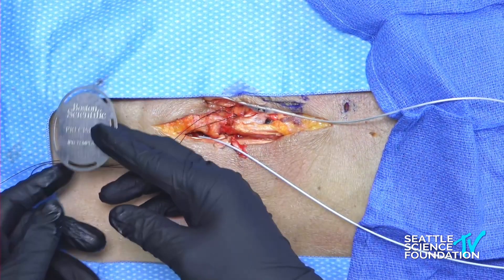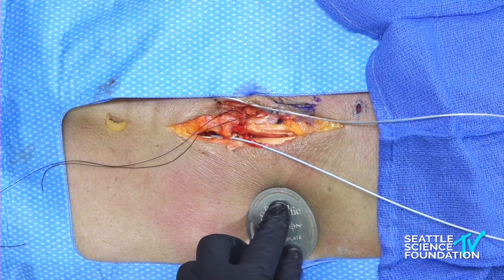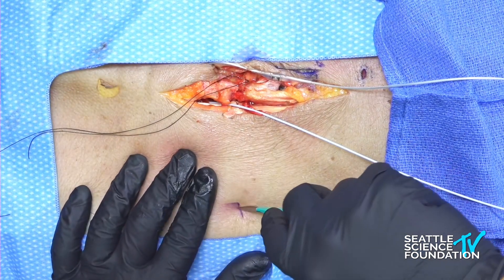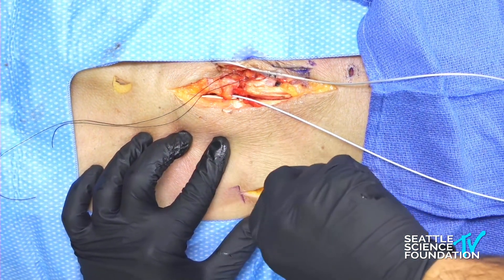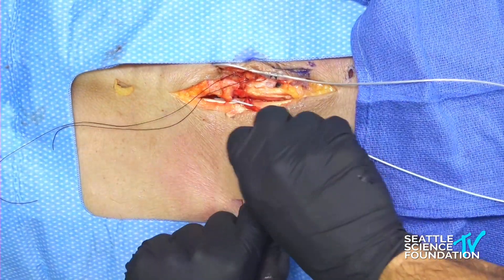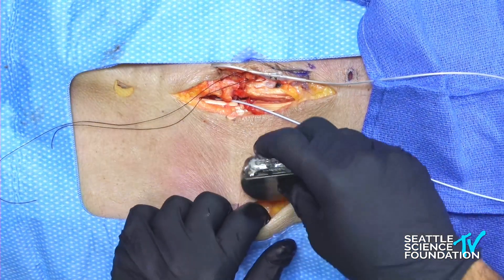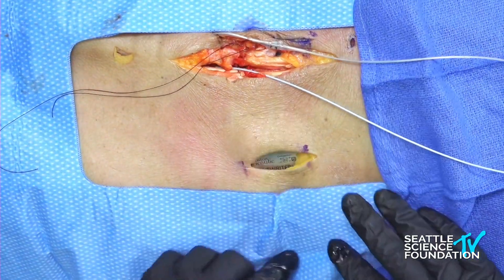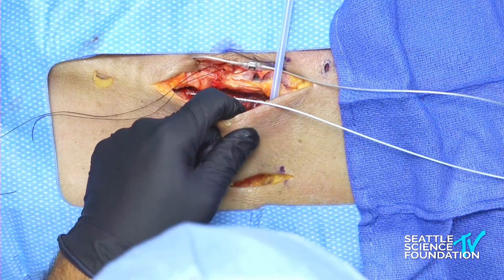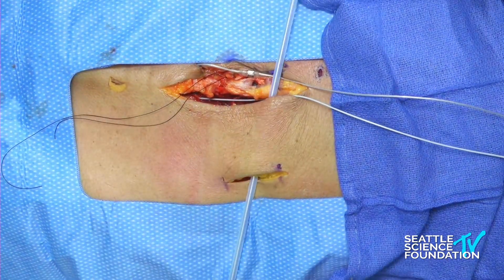We'll mark it and anesthetize the area. Opening this up, I'll cut down using Bovie to make sure there's no bleeding, and test to see if the template fits — you can see it's sitting pretty nice. This implant can't be more than one centimeter deep, otherwise they won't be able to charge it. If it's non-rechargeable, it can be as deep as you want. You can also test the actual battery in here. Now you have to create a conduit from the lead over to the battery — so you'll tunnel. I put a little curve in the tunneler to make sure we stay superior so it doesn't dive.